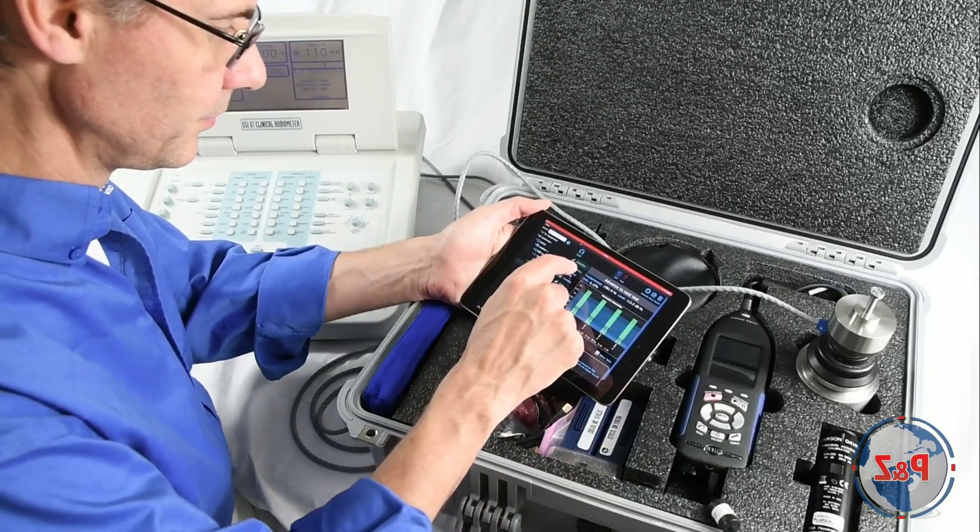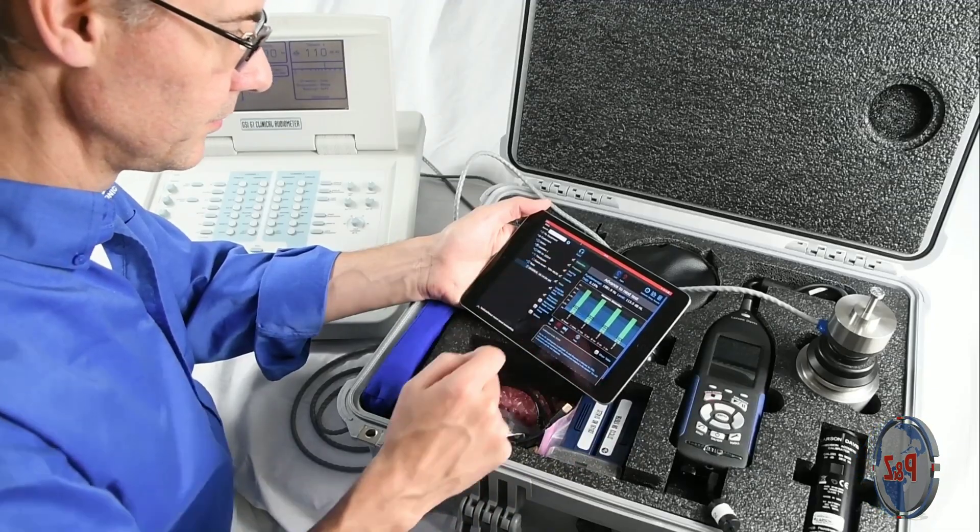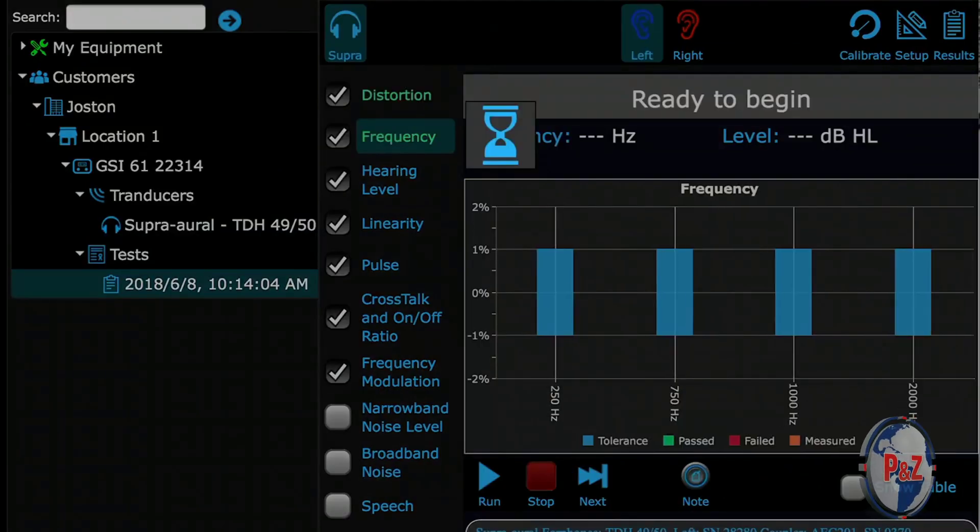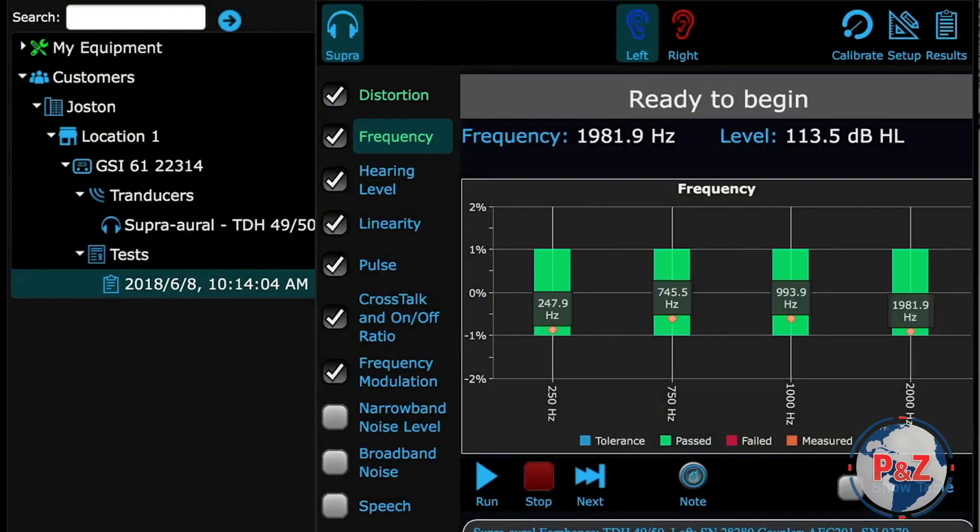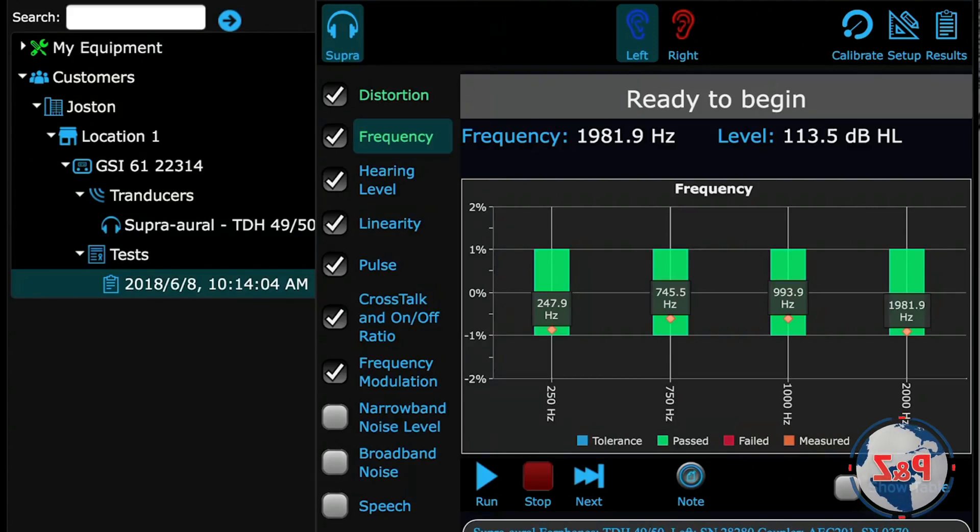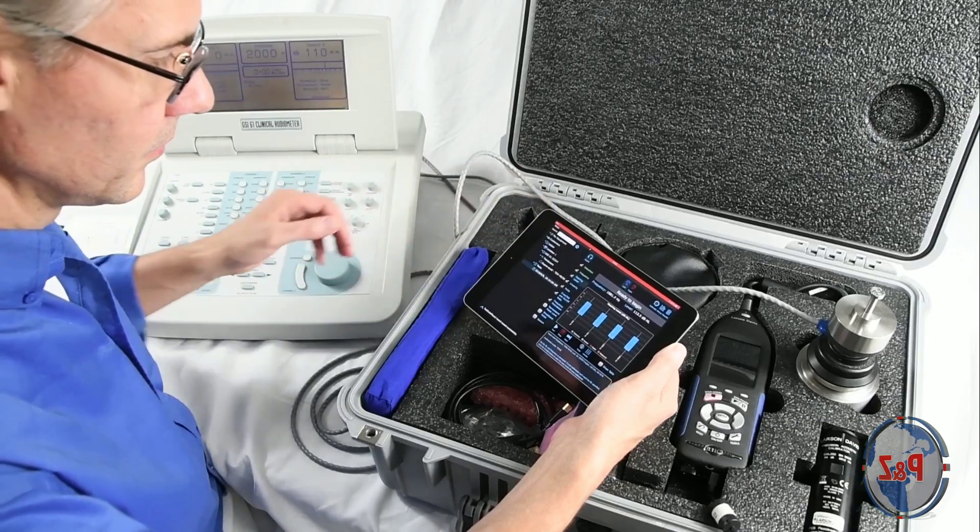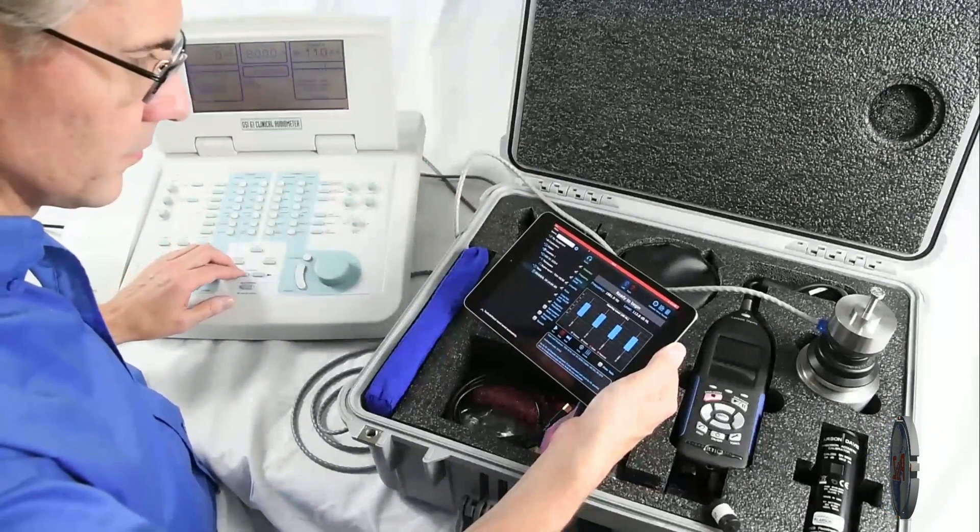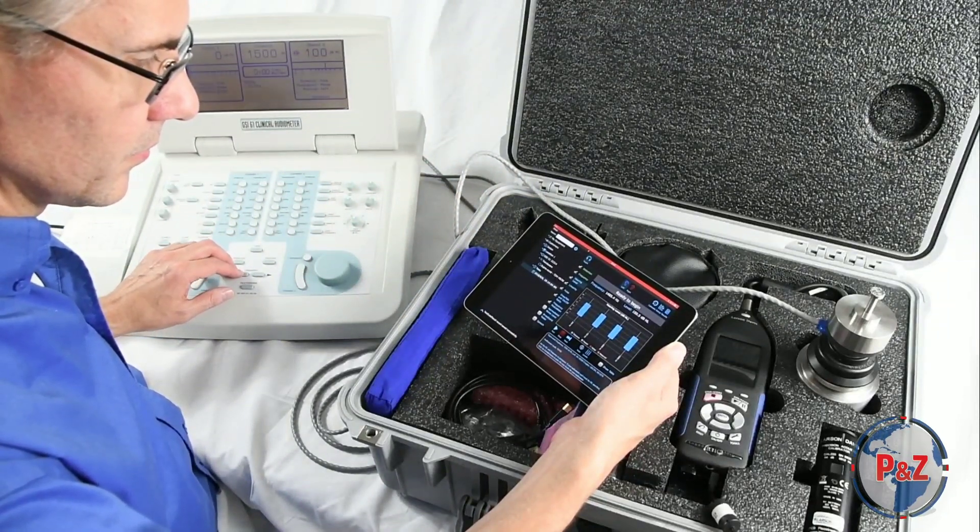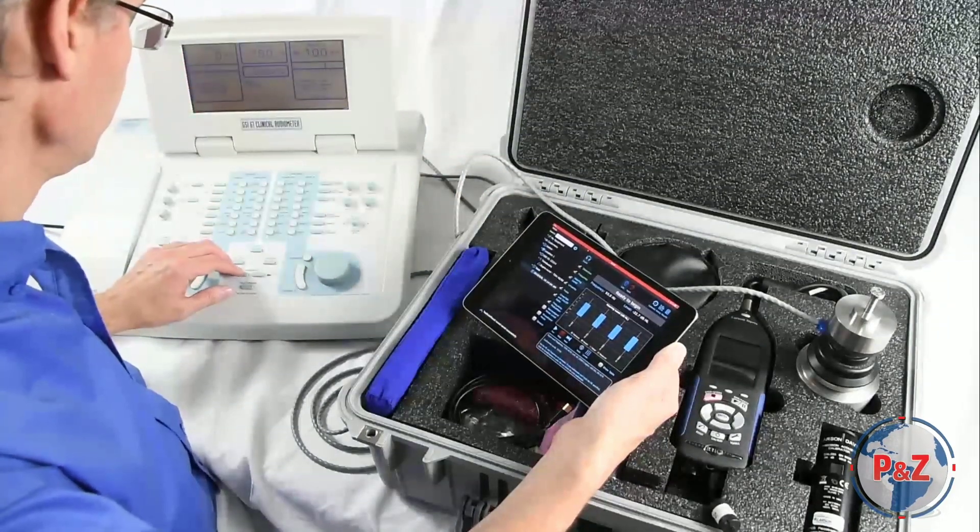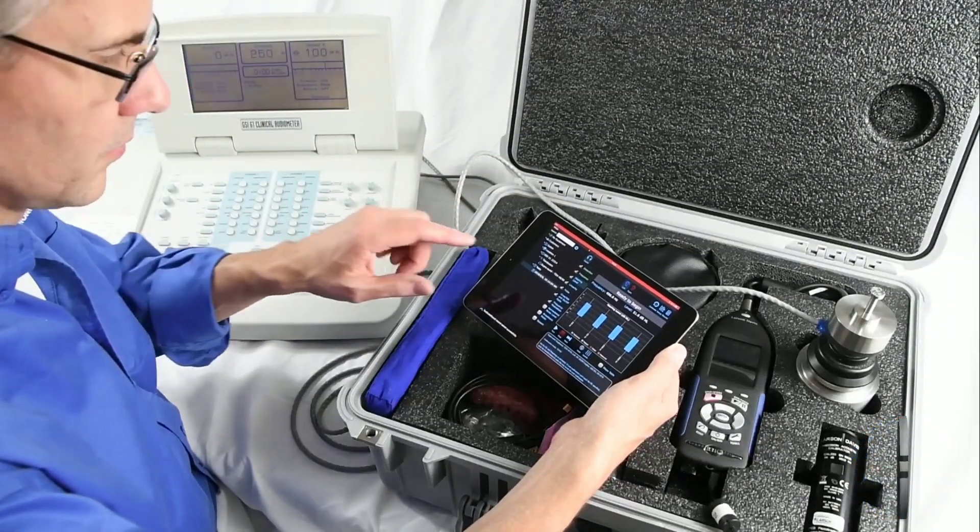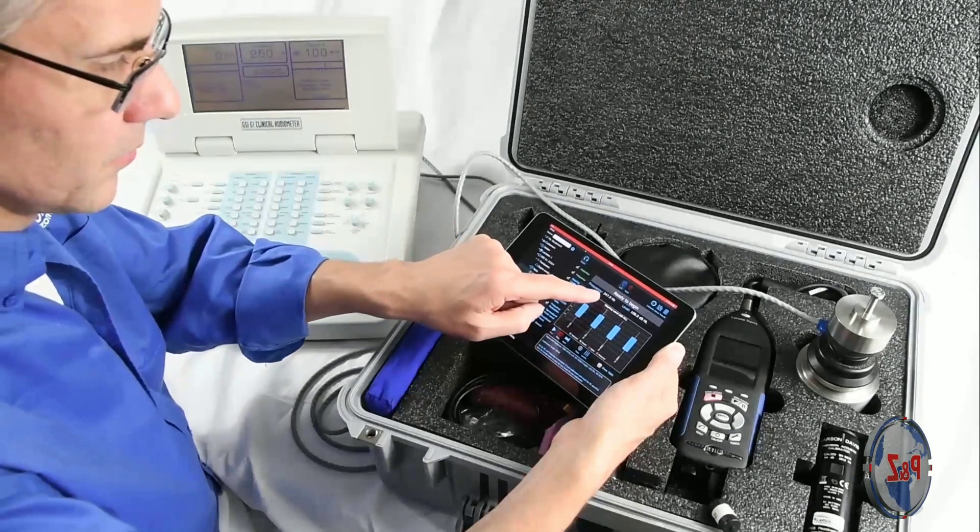Distortion and frequency require the same input, so those two tests run simultaneously if both selected. You can see the audiometer passed both tests. Brent is checking the current level for the hearing level test before running. You can see the live display of data at all times on each page.